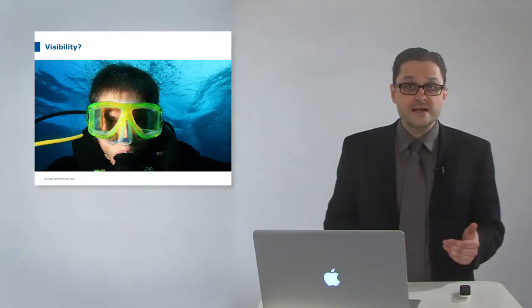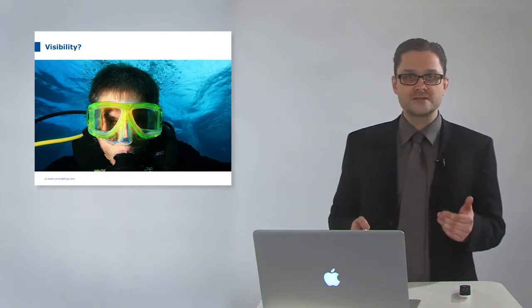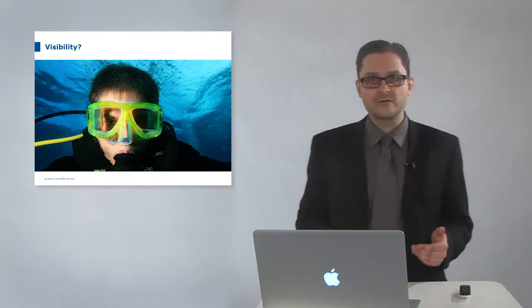The dentist can see if the post has to be placed deeper or if he is already preparing too deep or in the wrong direction. As a forensic aspect, health insurances sometimes want to see the pre-prosthetic work before they allow restorations to be done. To see the post clearly on the X-ray is a must for diagnostics.